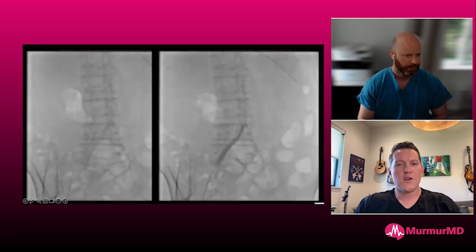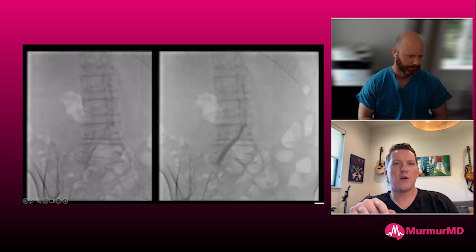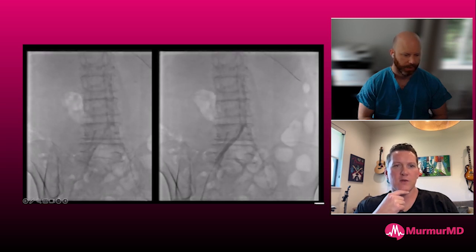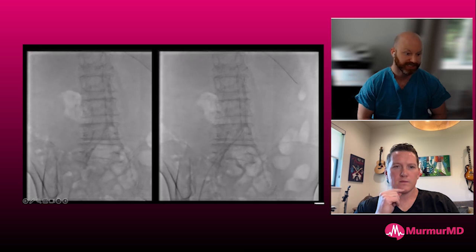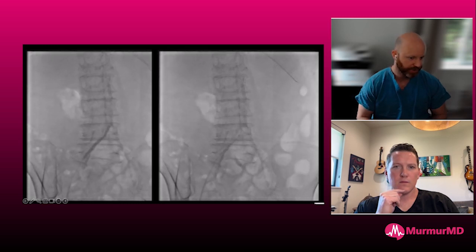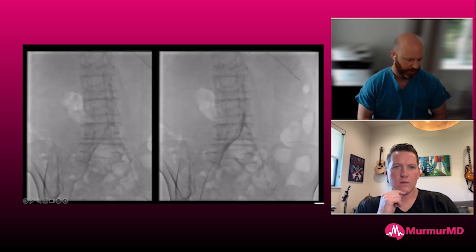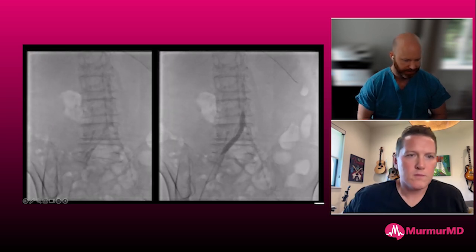Hey, Chris, a couple points though, too. I have a question: do you ever do distal protection with cases like this where there's bad iliac access and you're worried about ischemic time? Will you ever put in a distal perfusion catheter with Impella? Yeah, we have, but I find that generally speaking, the current side ports of every sheath that exists are inadequate in diameter to allow for really good perfusion of the lower extremity.